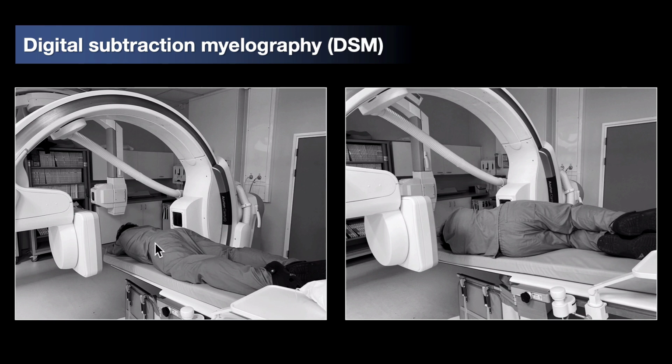Now first you position the patient depending on where you think the leak is. So I'd position them prone for patients with ventral SLEC and therefore thinking about a ventral tear, and then lateral decubitus for any kind of lateral leak such as a CSF venous fistula or diverticulum, and therefore you may have to do both sides. You do the lumbar puncture under fluoro, tilt the table, and then inject the contrast under a breath hold to limit motion, and then perform a rapid image acquisition.